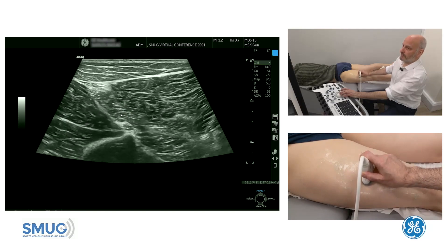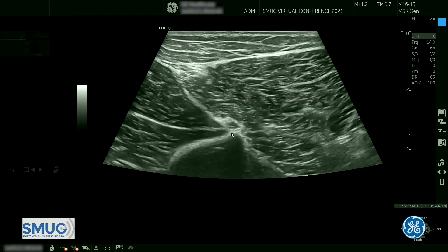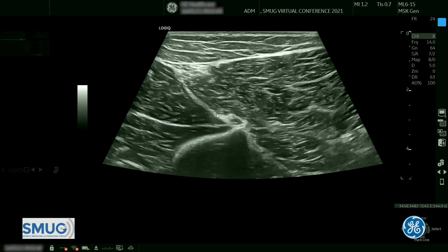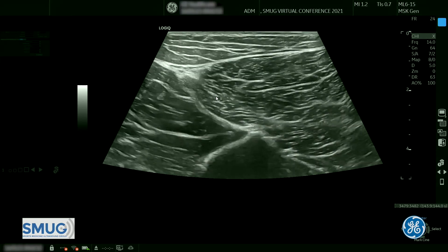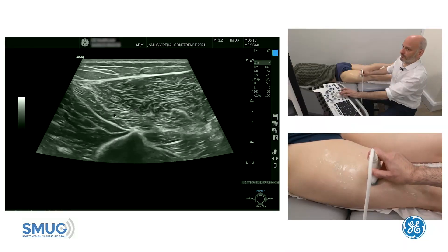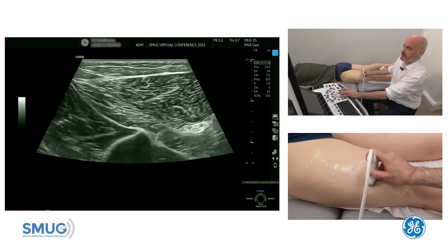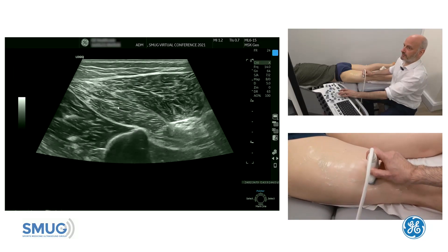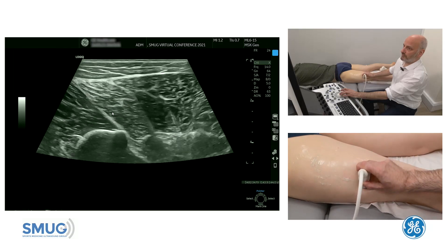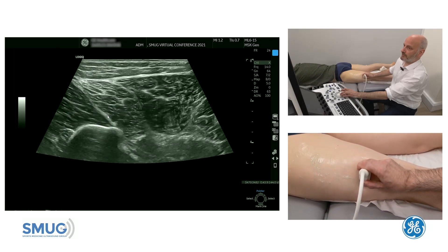There's also a little bony marker here, a little prominence where the fascia is attached. Once you have identified your short head — which is that tram line — you're going to go distally, and if you keep your eye on it, you can see the short head is getting bigger and bigger. I'll make it look more vertical for now just to make it a bit easier to explain, so you have the first and the second tram line here.